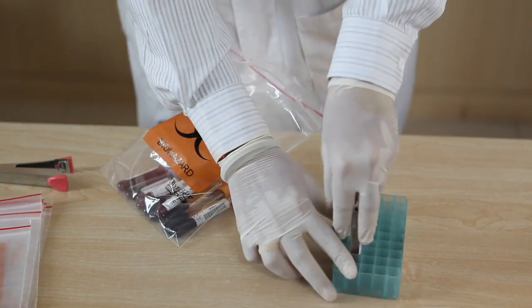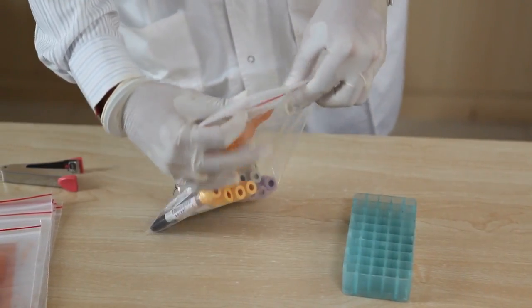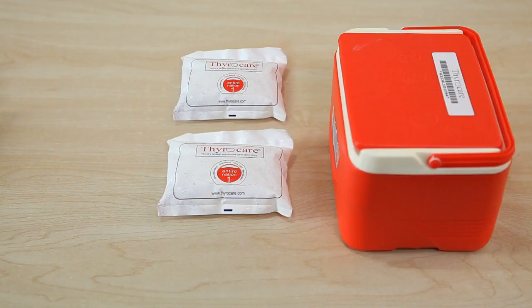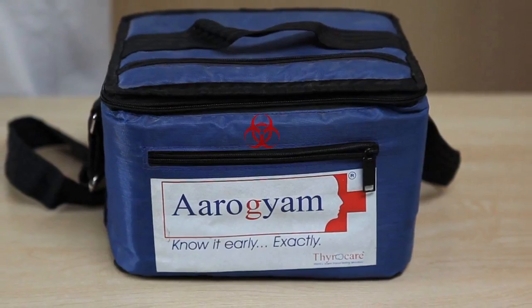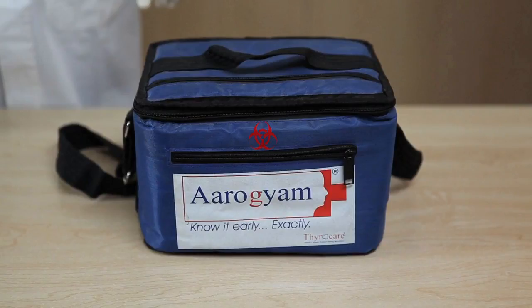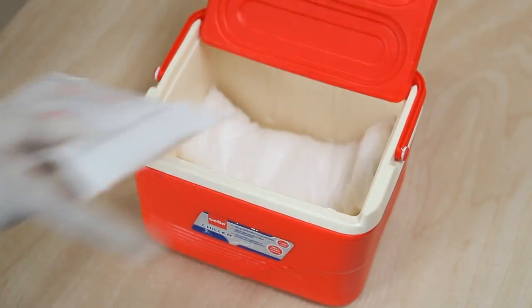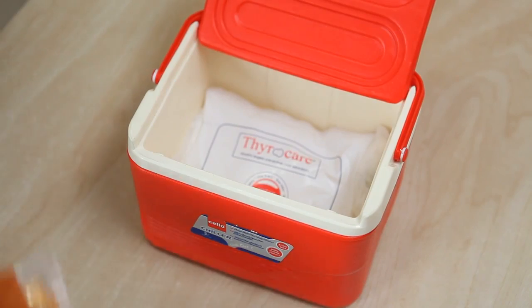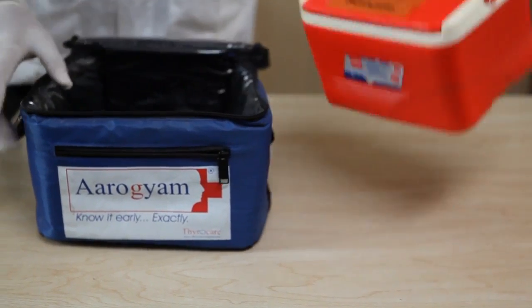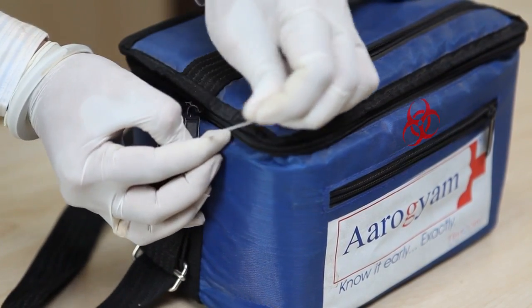The technician must collect all the barcoded vials and place them in primary packets, which are ziplockable and recognized by a biohazardous symbol. Secondary packaging includes chiller box, 2 layers of cool packs, and absorbent materials. Outer covering for chiller box must have the biohazard symbol with description of usage requirement. Place absorbent materials in the chiller box. Place cool packs in it. Place the primary packets in the chiller box. Lock the chiller box securely and seal it.